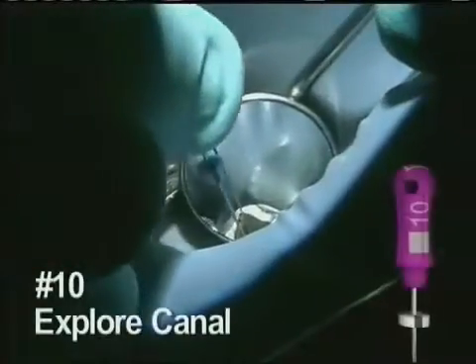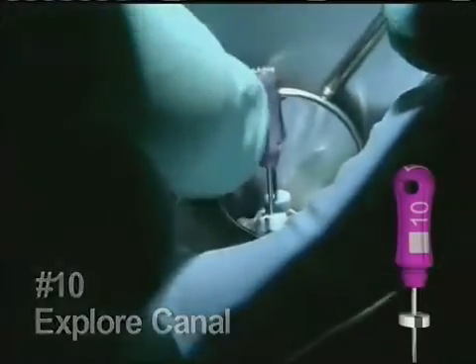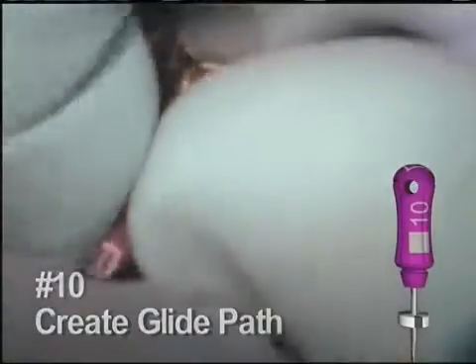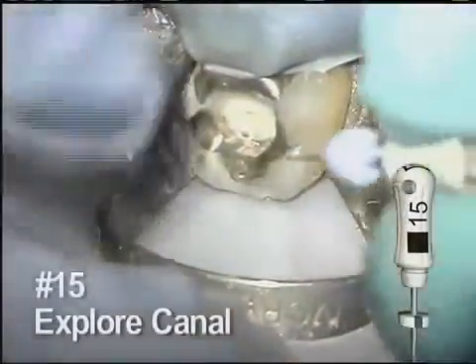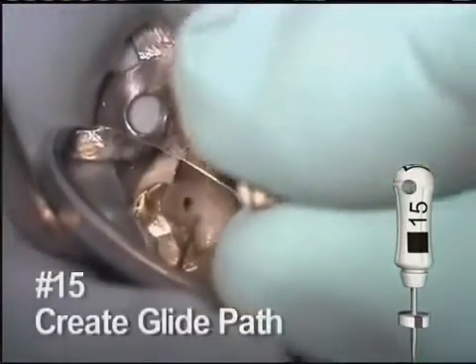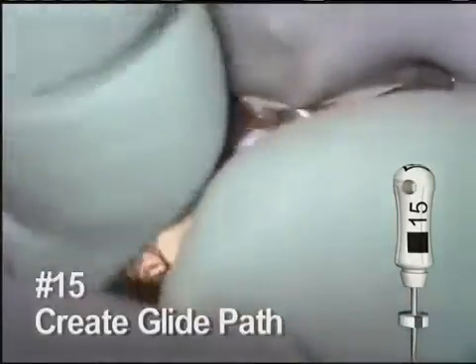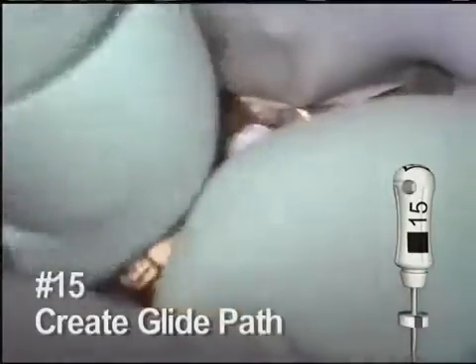Begin with a number 10 hand file. It doesn't take long to scout the canal space. This is worked to about two-thirds of the estimated depth of the canal. Based on the anatomy, the next hand file is pre-curved. This number 15 file is worked gently to create a glide path for the rotary instruments. It goes to about the same depth.